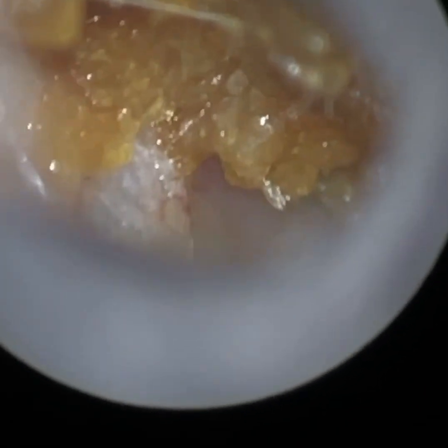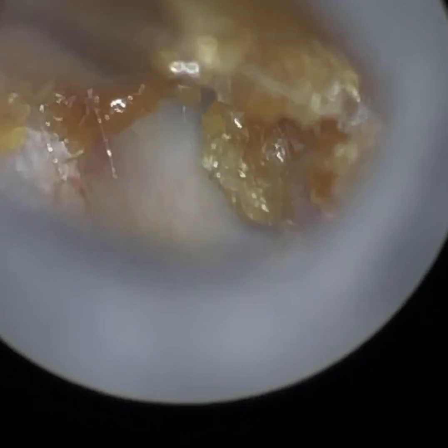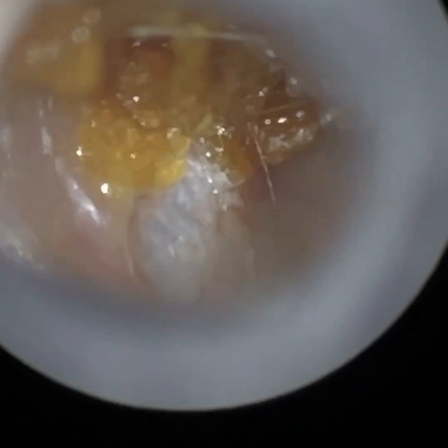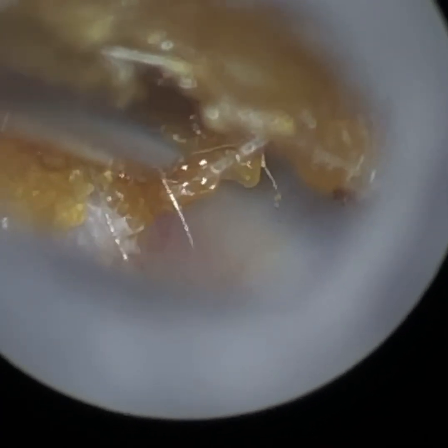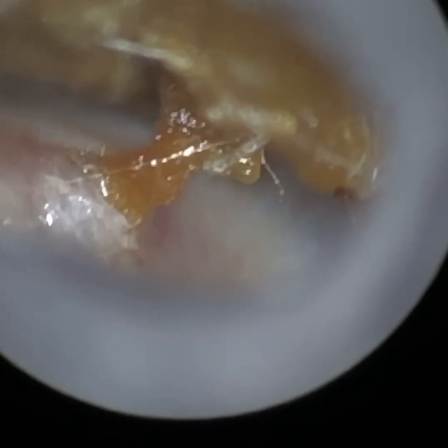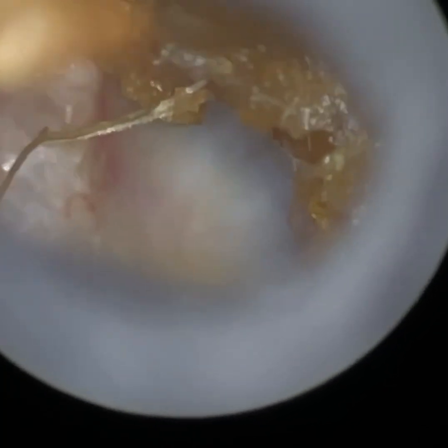This procedure is a very good demonstration of why I decided to develop the iClearscope after using loops, because with loops there's no way I'd be able to complete this procedure. This patient has a very narrow ear canal — that's one of the first difficulties. Also, the wax is very deep in the ear. I'm using the smallest speculum, the 3.5mm. I would never be able to remove anything like this using head loops. This is on the eardrum, and you'll see in a moment — when I remove this crusted dead skin off the eardrum, it's going to reveal the handle of malleus, which is directly behind the skin here. There we are — now you can see the handle of malleus.